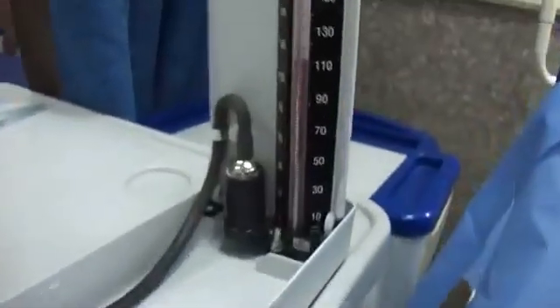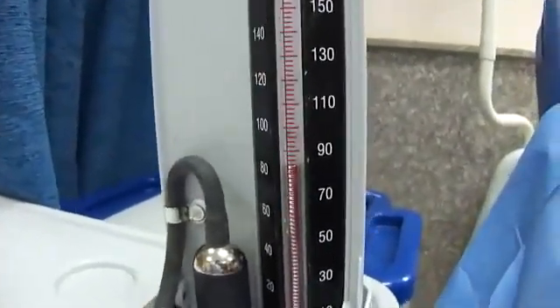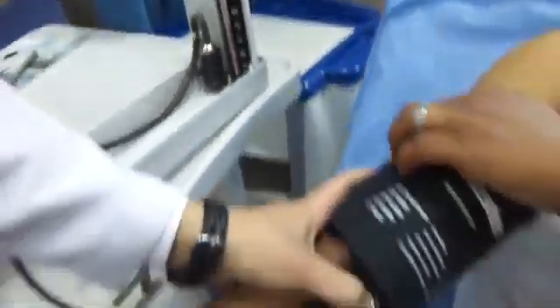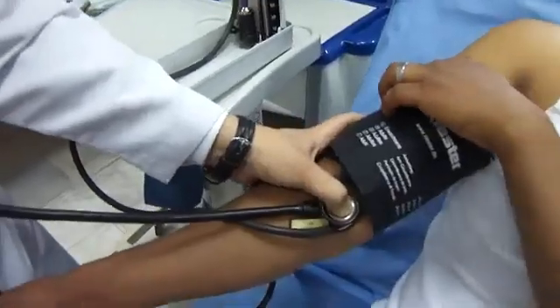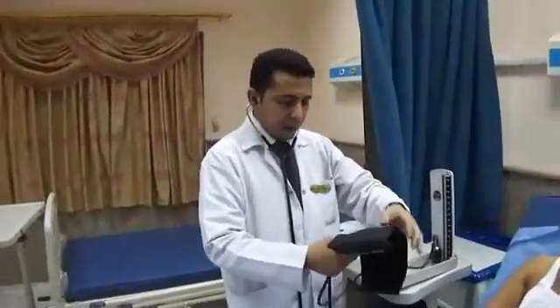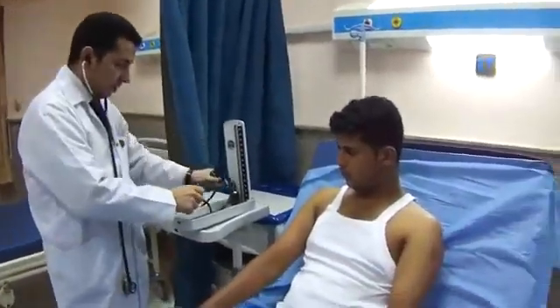I'll then deflate slowly, two millimeters at a time, until the sound is first muffled and then disappears. The blood pressure sound has now disappeared, which corresponds to the diastolic blood pressure. The systolic blood pressure was 130 millimeters of mercury and the diastolic blood pressure was 75 millimeters of mercury.